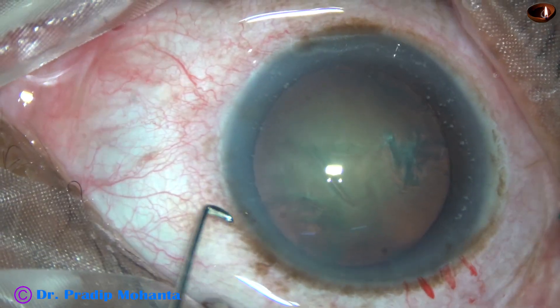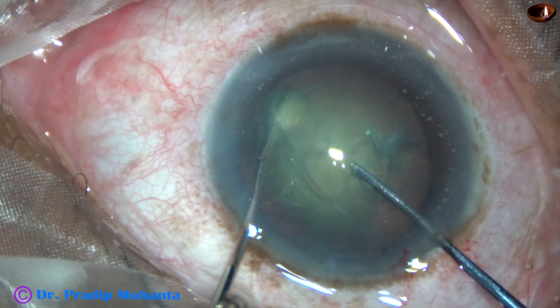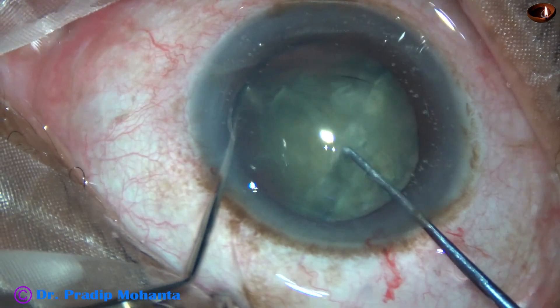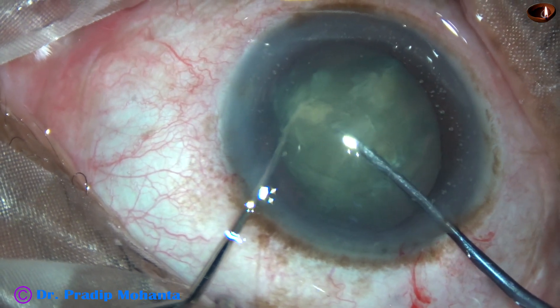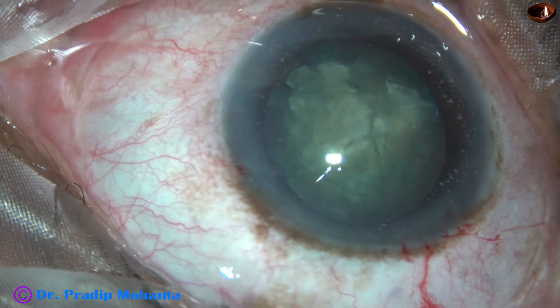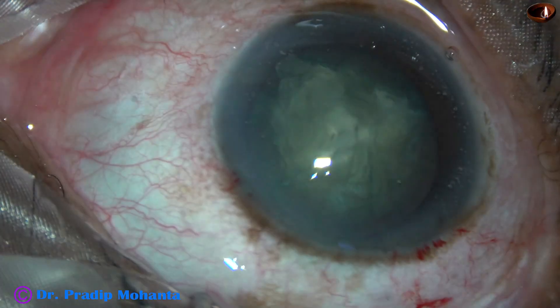After hydro-dissection and injecting visco in the anterior chamber, here goes the pre-chopper. The left hand instrument hooks the other equator. In this case, I could divide one hemi-nucleus nicely into two halves, and the rest of the surgery is going to be very easy — you just have to pick up the pieces and emulsify.